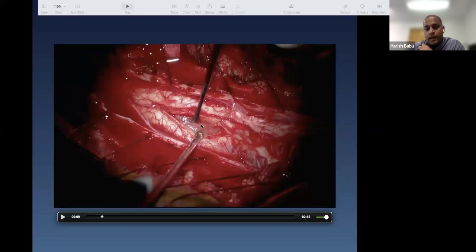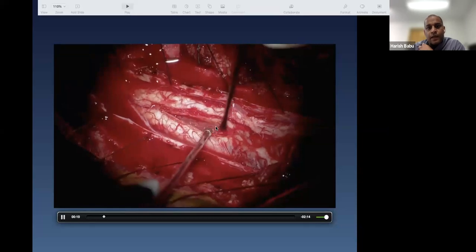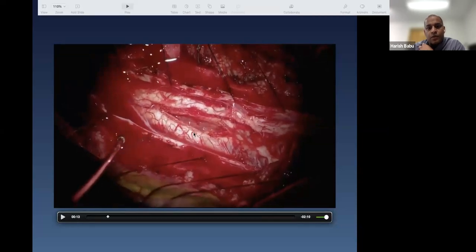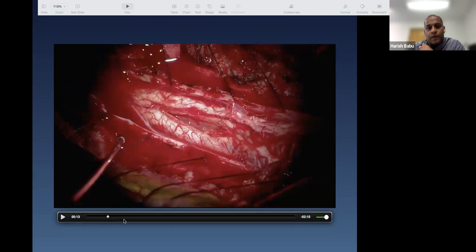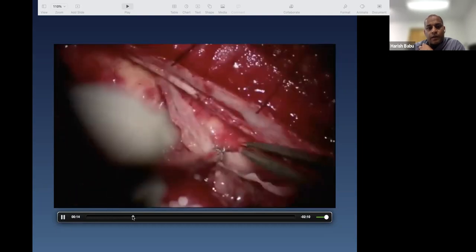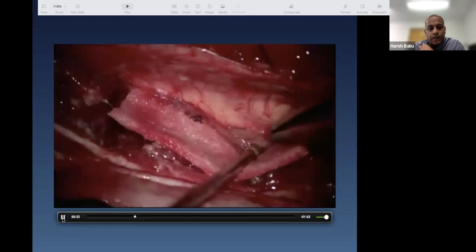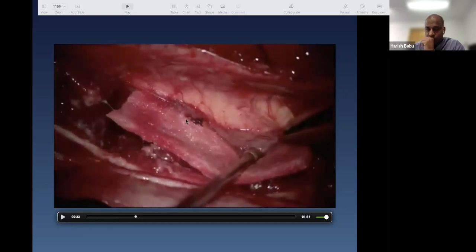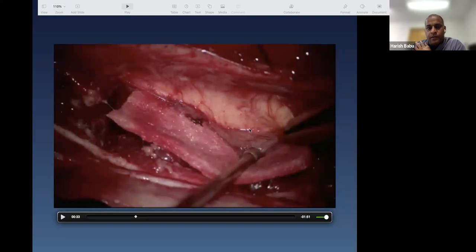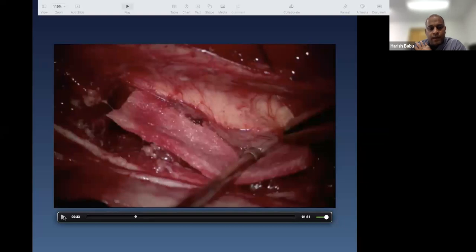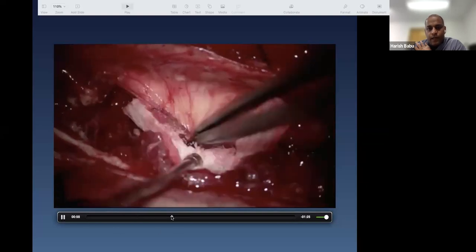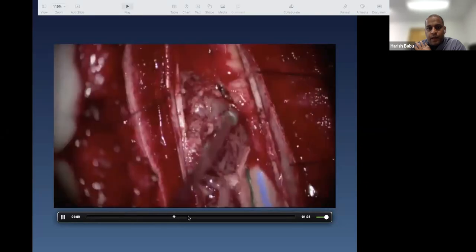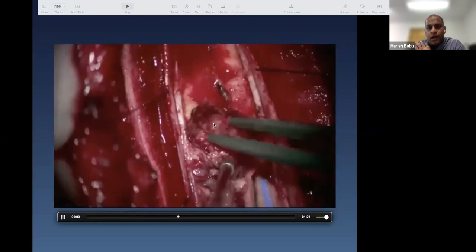The tumor starts to become clearly visible, looking separate from the rest of the spinal cord. These tumors generally have a very good plane of dissection. When they get bigger they do have some attachment points for their blood supply, but overall they tend to have a very good surgical plane between normal spinal cord and tumor.